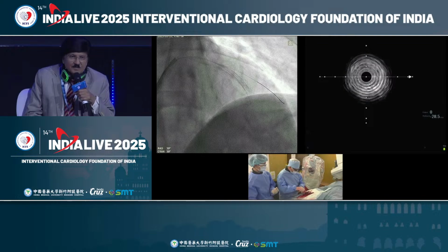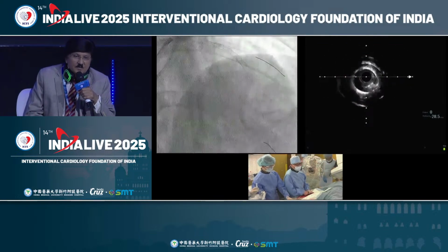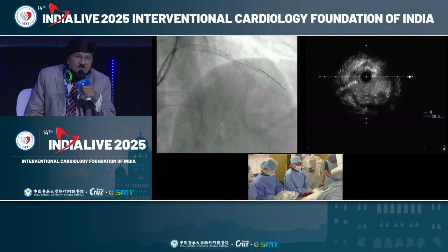Right. Thank you. Come back to us. We have 4 minutes left for your case. I finished implanting the stent. So now I will do IVUS imaging after the stenting, and post-dilatation with a 3.5 non-compliant balloon with high pressure. So please show that.